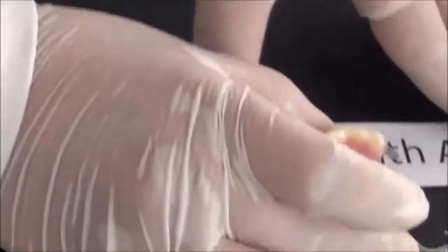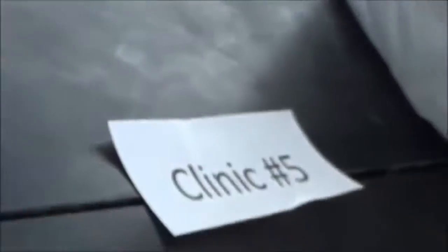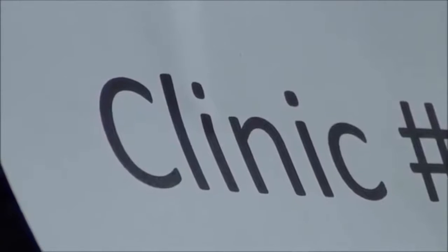And the final acrylic RPD, after finishing and polishing, making sure all of its extensions blend smoothly inside and outside with the metal, is sent back now to clinic number 5, where the dentist is ready to deliver this RPD. And I hope your patient goes out happily, and they might come in later for a recall visit if they have any complaints to be treated on the spot, similar to the complete denture procedure. Thank you.